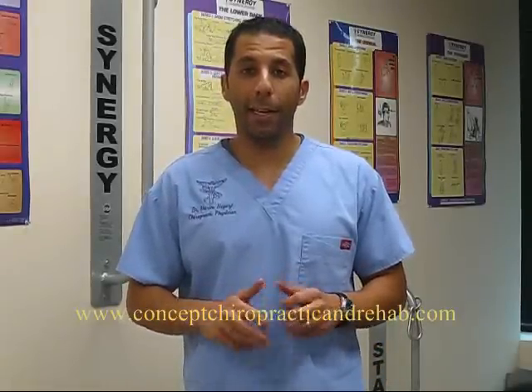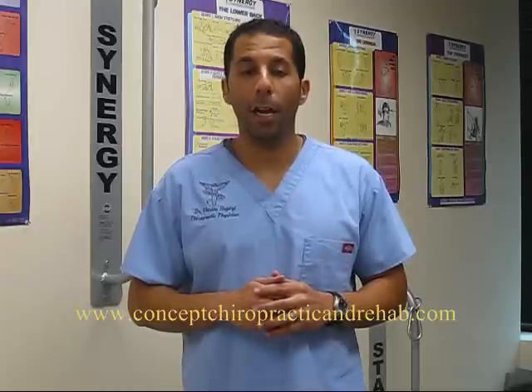Today I'm going to talk about the Graston technique. The Graston technique is an interdisciplinary treatment we use here at Concept Chiropractic, and I use it for all kinds of conditions, but today I'm going to show you how it works well with low back pain and chronic low back pain injuries. The main focus of the Graston technique really is reduction of adhesions and scar tissue that are a result of several different things.